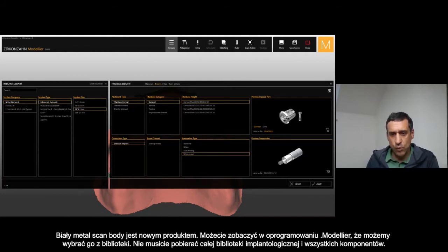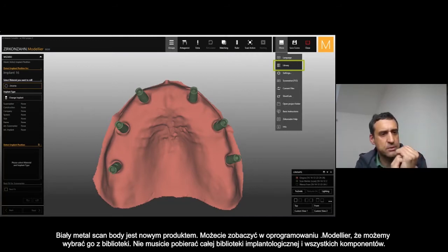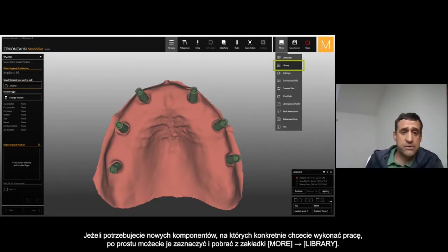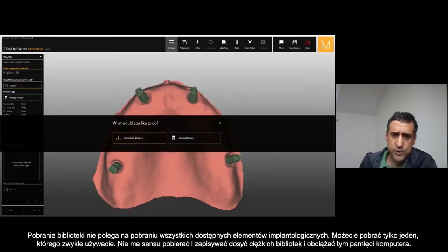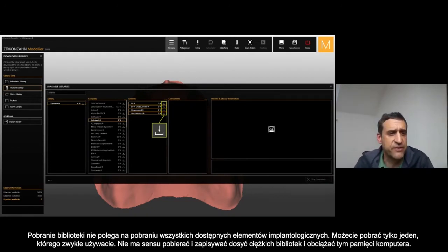The white metal scan body is the new scan body — really, really nice. When you want to update to a new model in your software, you can download just the library parts you need. We don't need to download all the implants and all the components. Really easy — when you need some new components or implants, go into the menu, find library, and from there you have the option to download libraries.